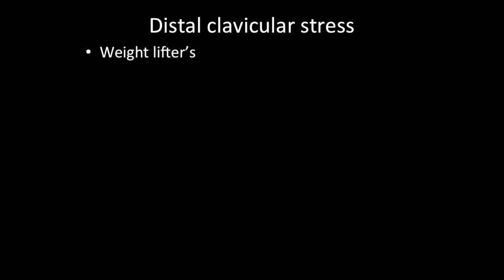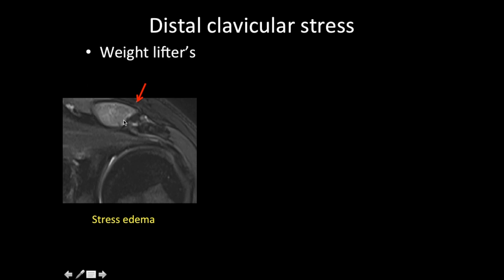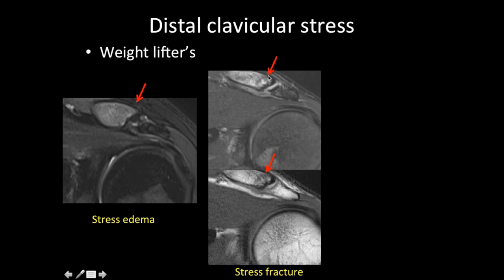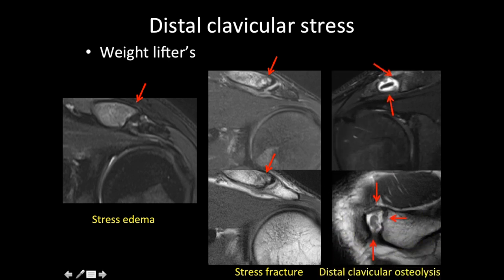Before finishing, let's discuss distal clavicular stress, commonly seen in weight lifters. Repeated weight lifting causes multiple micro-fractures in the clavicle, which can result in marrow edema in the lateral end of the clavicle — called trabecular edema — or can cause a stress fracture seen as a hypointense line. Alternatively, repeated micro-fractures can lead to osteolysis of the lateral end of the clavicle, called distal clavicular osteolysis or 'weight lifter's shoulder,' showing widening of the joint space, an irregular lateral clavicle margin, and potentially a chondral body within the joint.